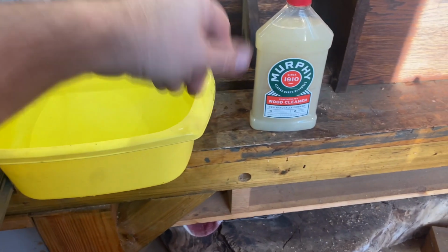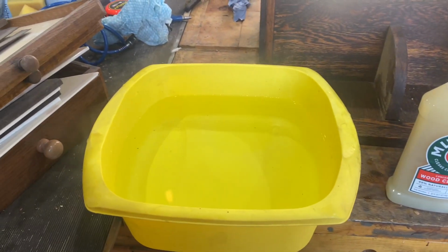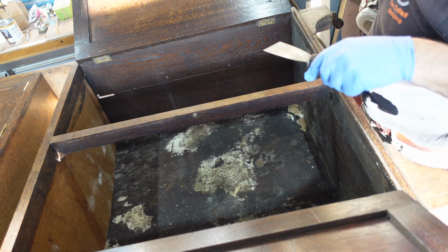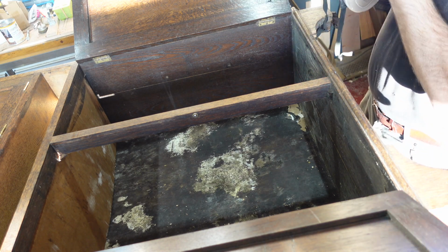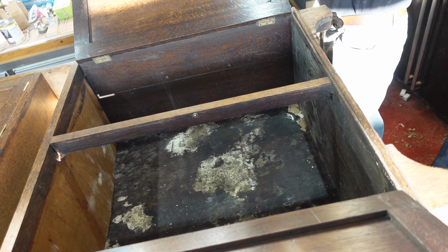So I'm going to use this Murphy wood cleaner mixed with some warm water to clean the inside. Because I don't know what this is, looks like some sort of mould or fungus, so I'm going to be putting on a respirator and wearing gloves.